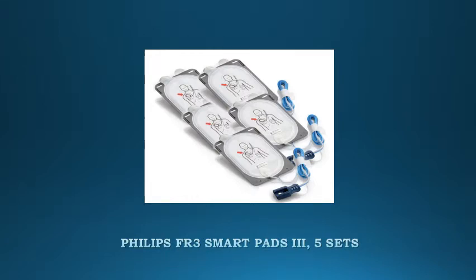Philips FR3 Smart Pads 3. This pad is a replacement AED pad for the Philips HeartStart FR3 AED. The Philips FR3 AED pad can be pre-connected to the FR3 AED, or you can update the AED settings for non-pre-connection.